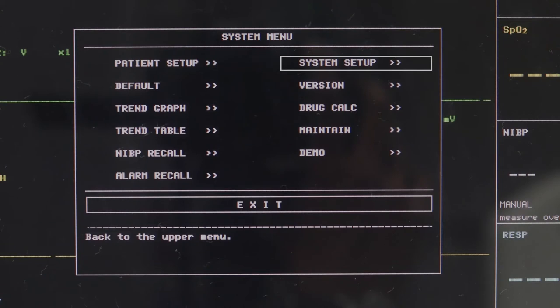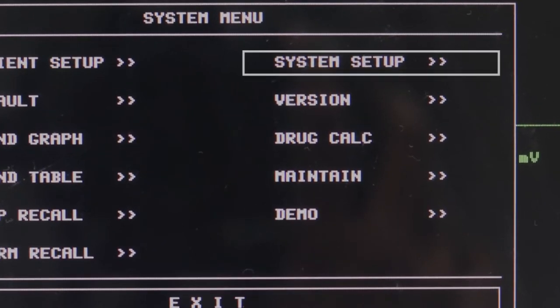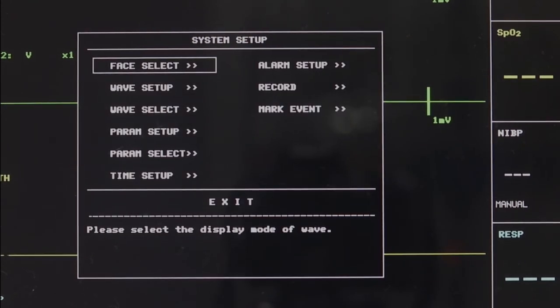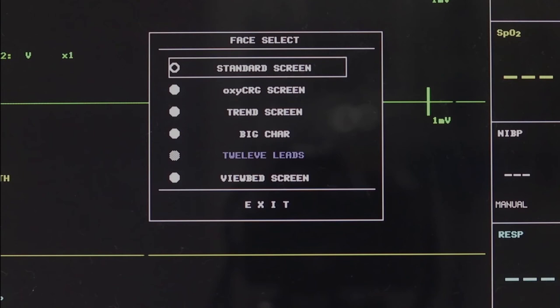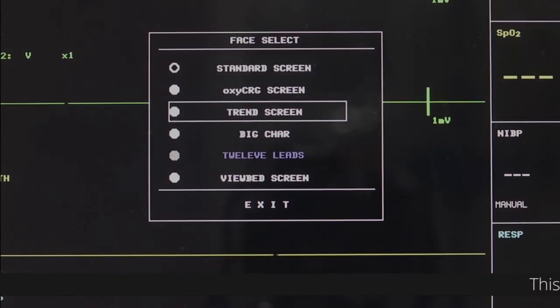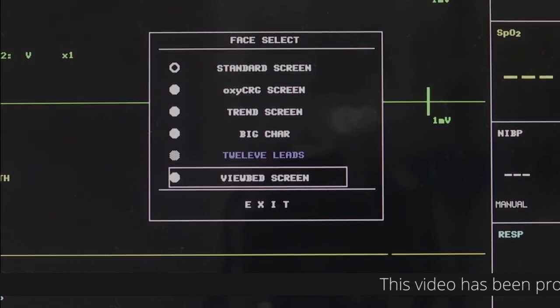System Setup - Face Select: There are five options available. Standard Screen, OxyCRG Screen, Trend Screen, Big Character 12 Leads View, and Bed Screen.